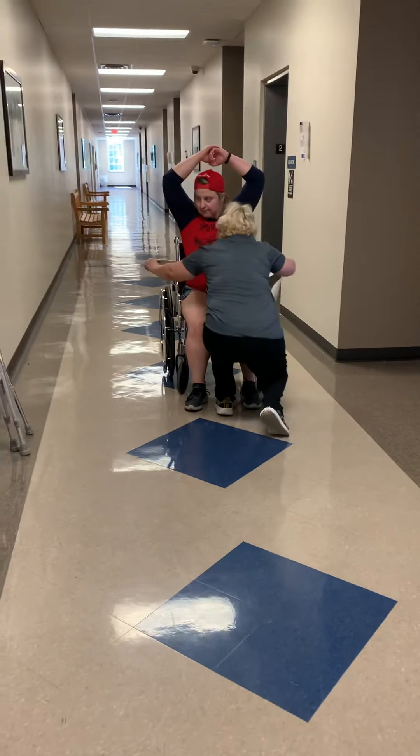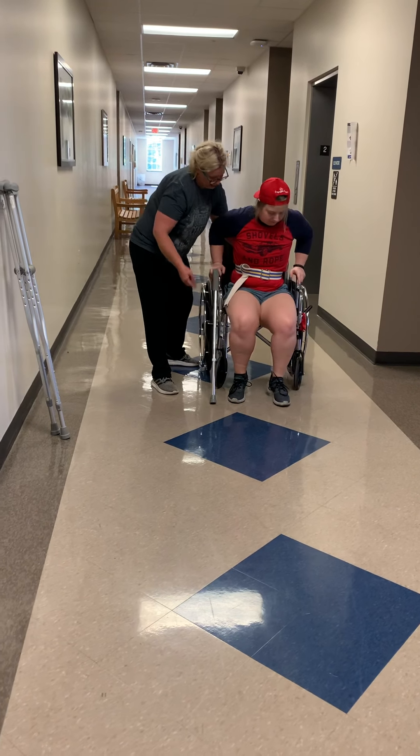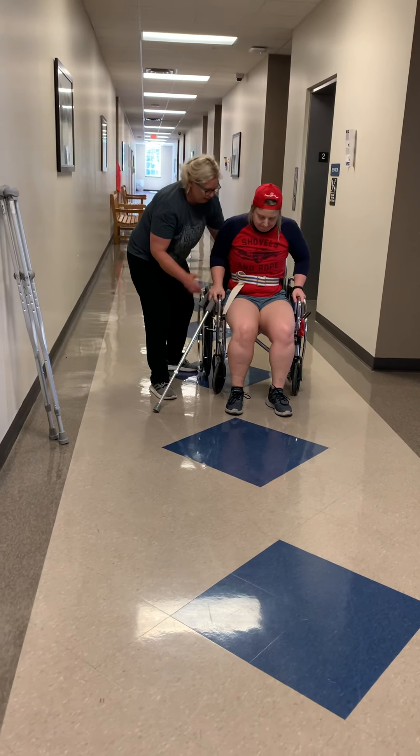Let's see here — does that feel okay there? You might need to kind of adjust that down a little bit. Let's scoot back a little bit so you can feel that hit your knees. We'll slow this down. I'm a feisty old lady! You are — quick, feisty, feisty, feisty. There it is. That feels better. All right, we're going to try that again. We're going to count to three. One, two, and three. All right.